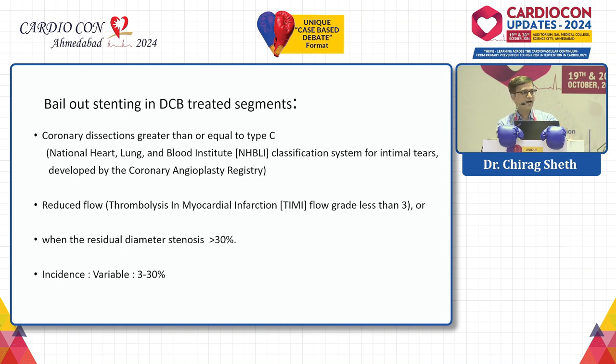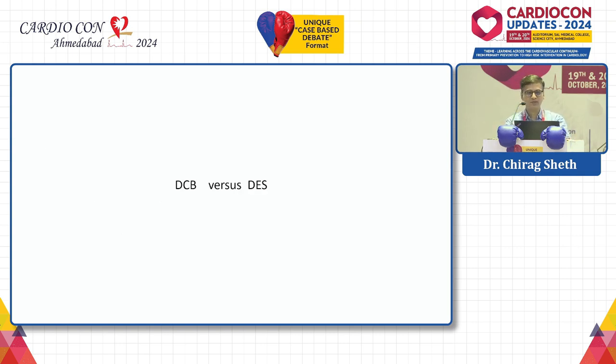So we have to keep that arm open. It's not that we dogmatically say that I will continue to treat with DCB only. In the event of these adverse events, the option of bailout stent always has to be there.